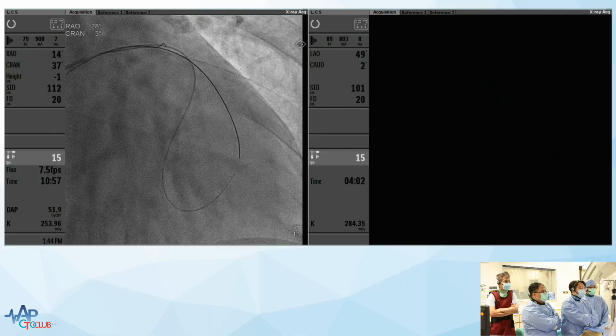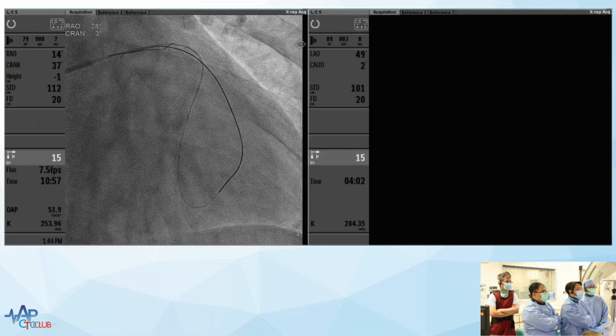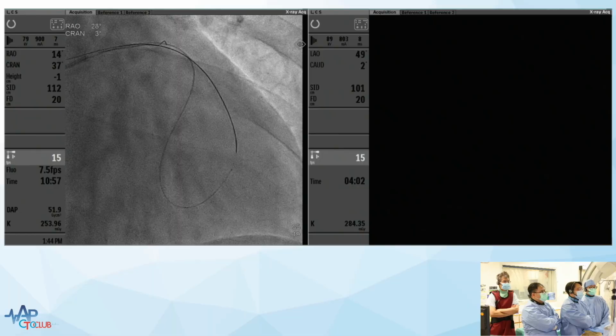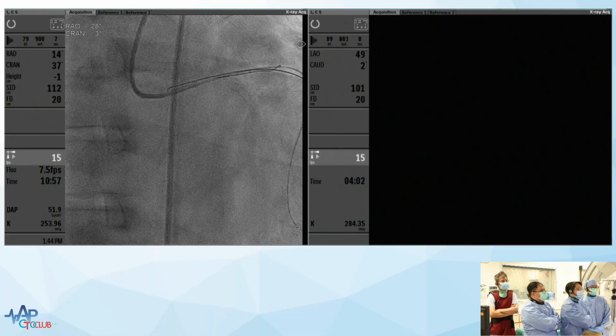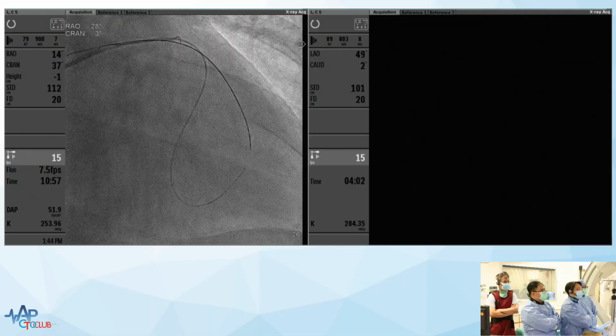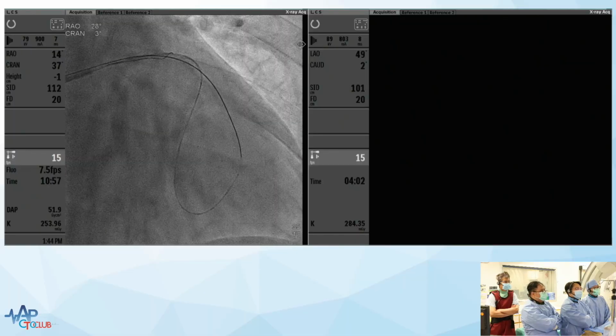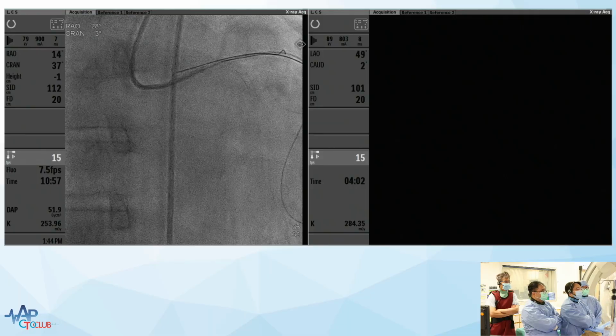Or puncture the other one and use a double guide, and I want to put the retrograde wire into the new guiding guide.